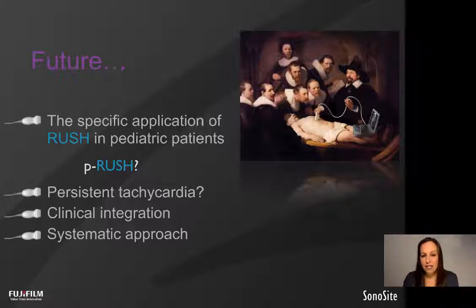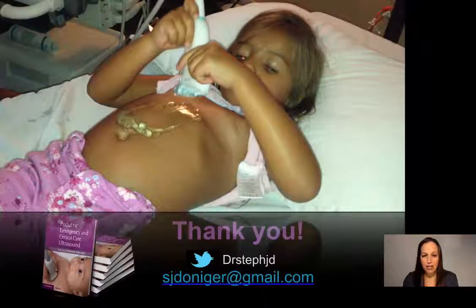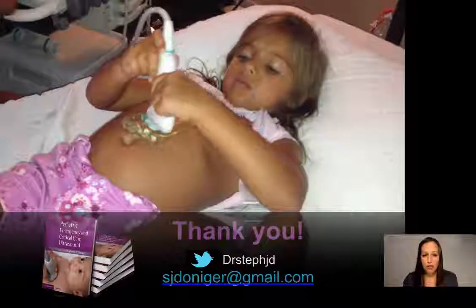But regardless, it's really important to keep in mind that this is an algorithmic approach so that you can remember the different components and that you can integrate this with all of your clinical information into a systematic approach. So it was a lot of information, but I think it's important to use the pediatric RUSH.